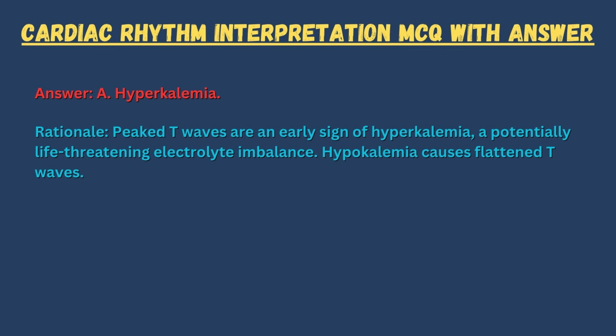Answer: A. Hyperkalemia. Rationale: peaked T waves are an early sign of hyperkalemia, a potentially life-threatening electrolyte imbalance. Hypokalemia causes flattened T waves.